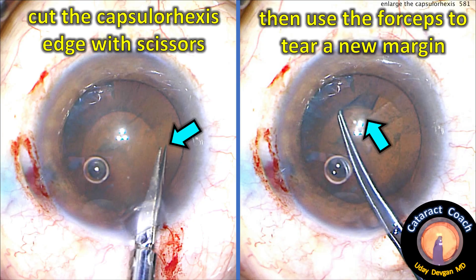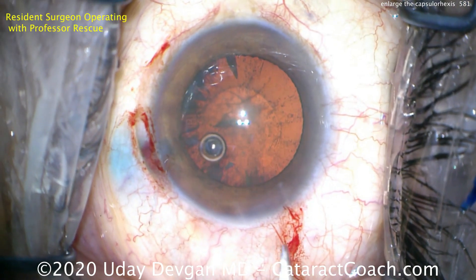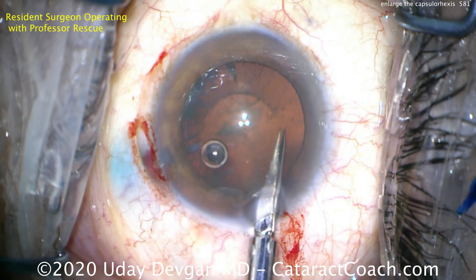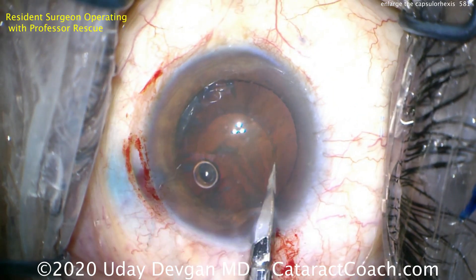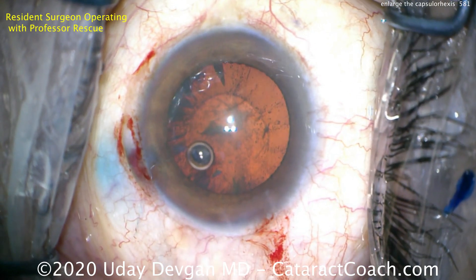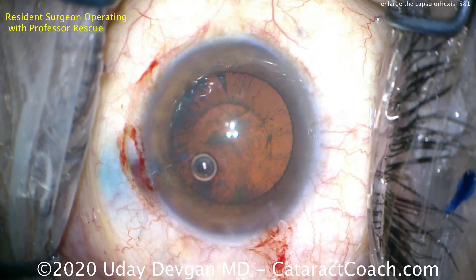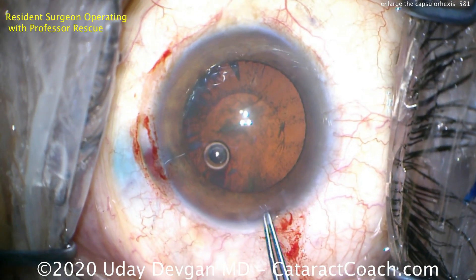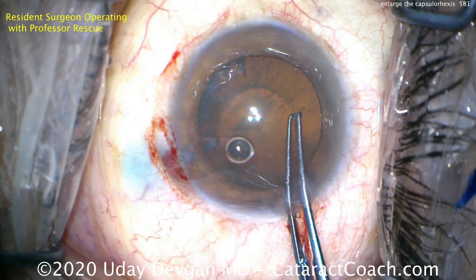Using the Vannas scissors, we cut the edge of the capsulorrhexis very gently, then use forceps to tear a new margin — tearing off this extra crescent-shaped tissue. It's very important to cut very tangential to the edge. There it is — just a little tiny snip is all it needs.